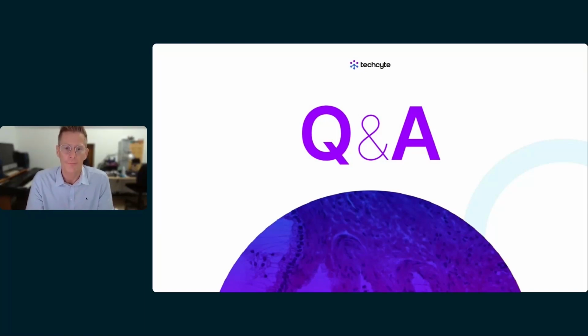It then learns it, and we are then able to do that on samples of things it's never seen before. But in terms of unusual morphologies, what our software is good at is, if it has been trained, for example, on yeast or filamentous mycelium or hyphae or epithelial cells or anything, it does detect anomalies but still groups them, and it will present them.